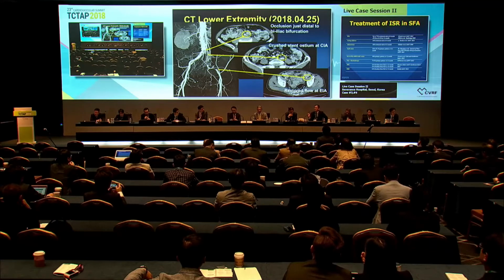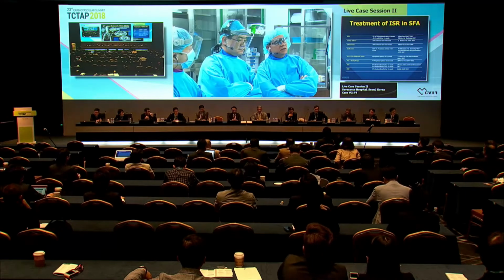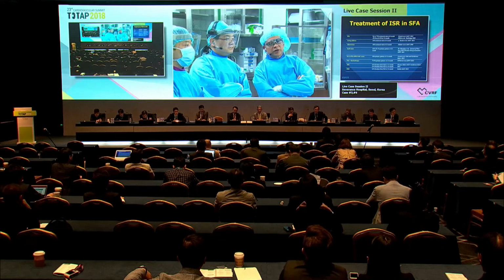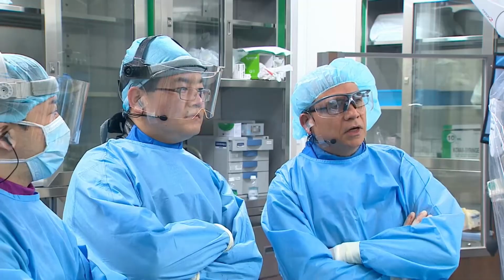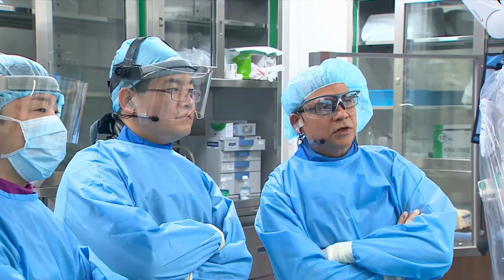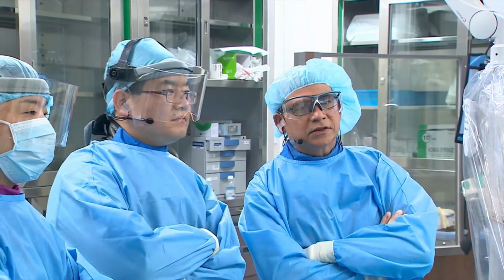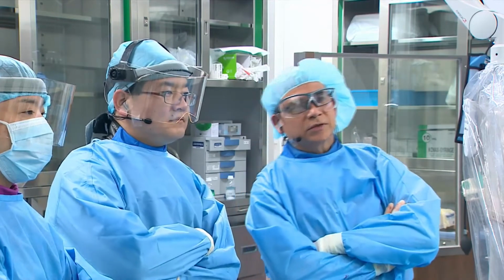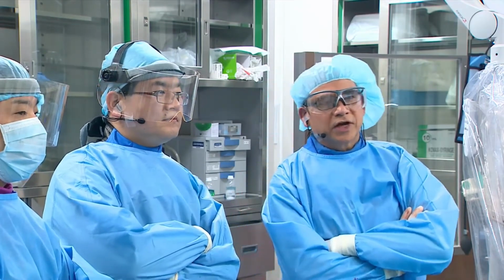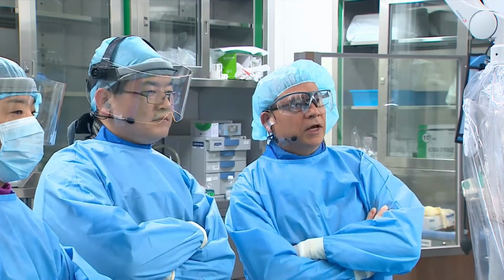Dr. An, Dr. Sunarayan here. Dr. An and I discussed the case prior to starting, and we both agreed that we would try and go to the lumen. Luckily for us, when you look at the CT scan, the stent is actually across the orifice of the internal. So the distal end is available via the external quite easily, and you don't have to negotiate the bifurcation to get to the occlusion, which often, as you know, because of the anterior angulation, can be difficult, and you could easily end up subintimally.